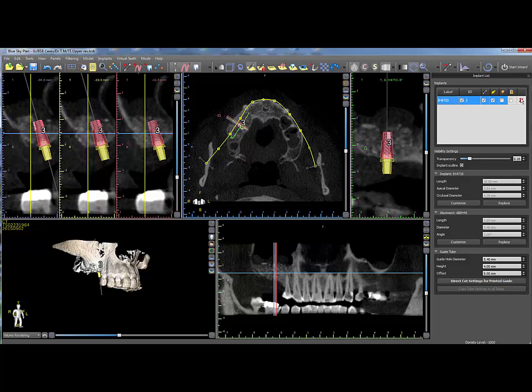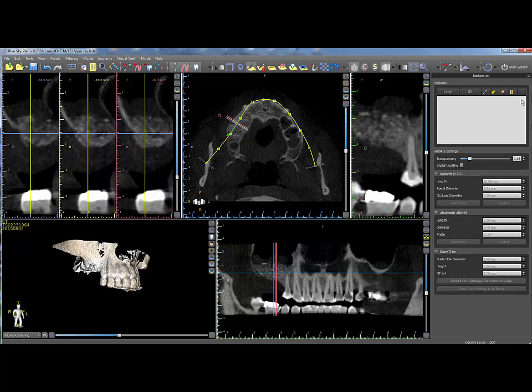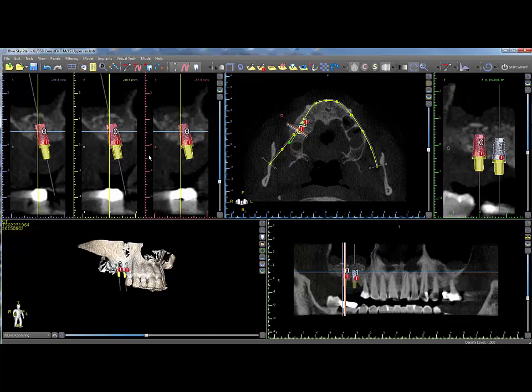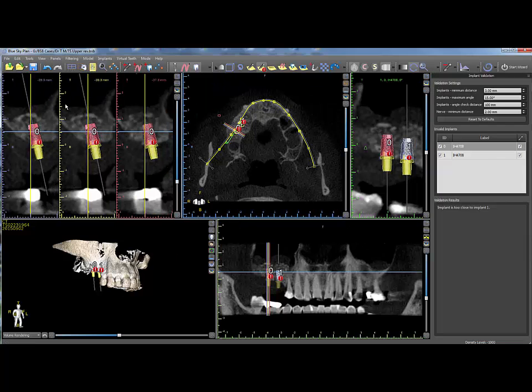Clicking on the X will delete the implant from the treatment plan. To set parameters for proximity or collision detection settings, click the Panels menu and Implant Validation. In the Implant Validation panel, edit the fields as necessary to control the distances at which warnings will be issued. Implants that violate proximity settings will appear with an exclamation mark and will list in the Implant Validation panel under Invalid Implants.